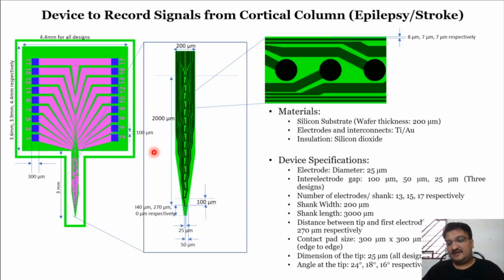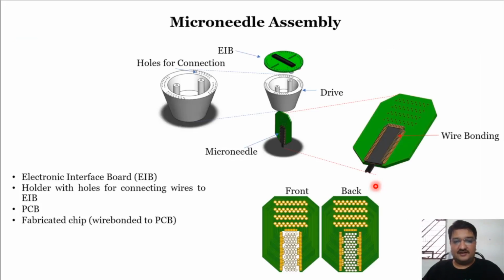The rest of the things already exist in the real world, but you should know how you can get this kind of design, for which all the basics of microfabrication are very important, so that you can pattern the desired number of electrodes with proper contacts in order to get the desired microelectrode arrays. I hope this microelectrode portion is understood and clear.